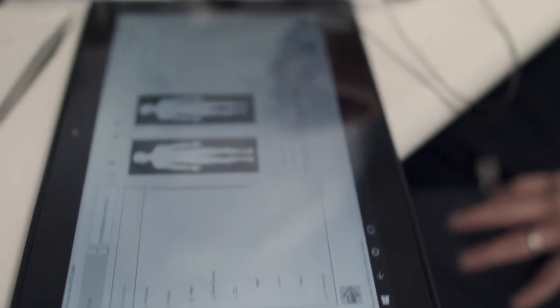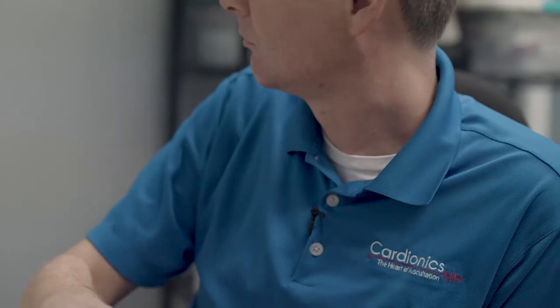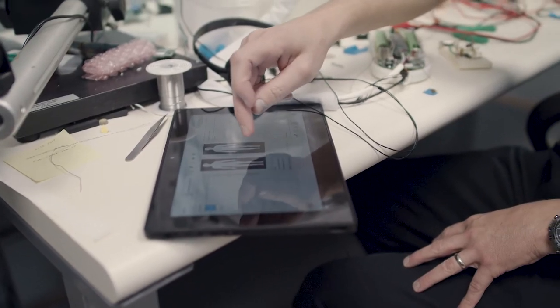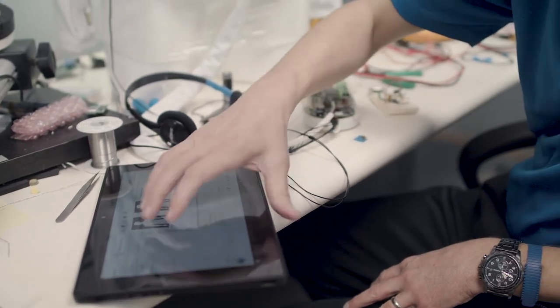The sim suit comes with software that allows you to change the conditions. The actor wearing the suit can act their condition, but the suit also allows them to present those real conditions to the student. The software also allows them to change those conditions on the fly.